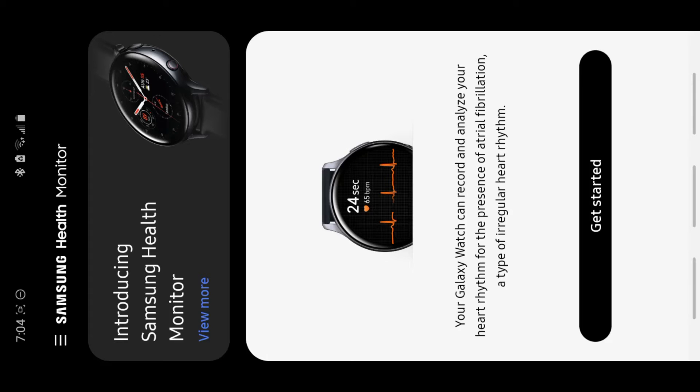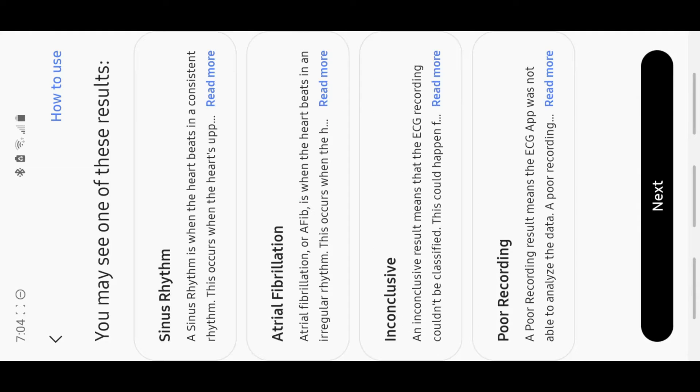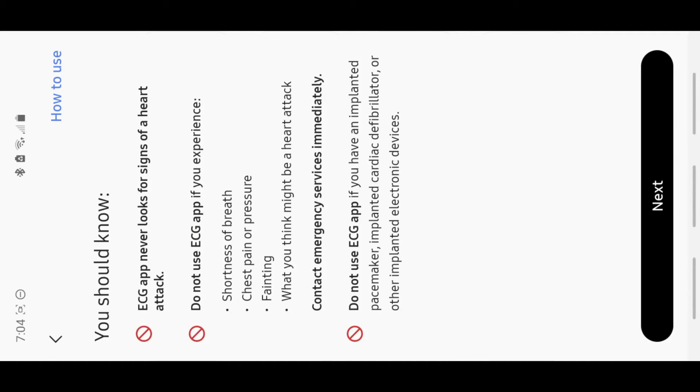Introducing Samsung Health Monitor. View more — how the ECG app works. These are the results: Sinus rhythm, Atrial fibrillation — I cannot say that word for the life of me — Inconclusive, and Poor recording. You should know the ECG app never looks for signs of a heart attack. Do not use the ECG app if you experience shortness of breath, chest pain or pressure, fainting, or what you think might be a heart attack.